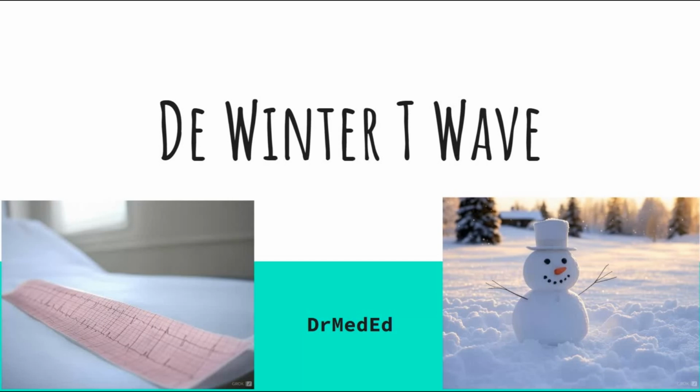If you're in the medical field or simply fascinated by ECG patterns, stick around as we dive into the fascinating world of the De Winter T-wave. Let's get started.